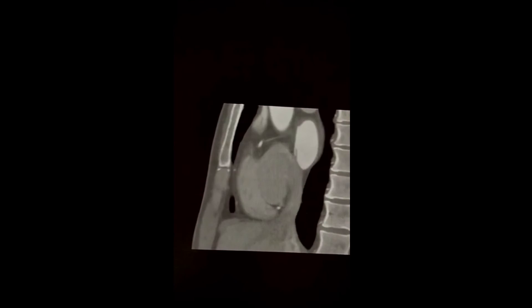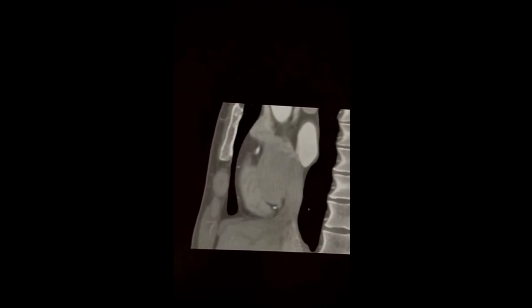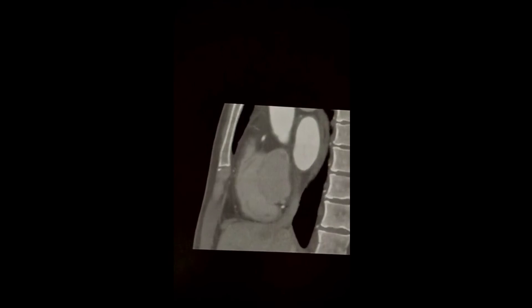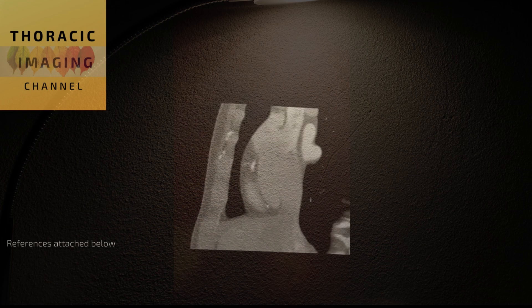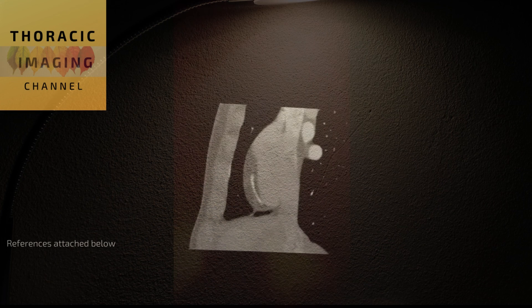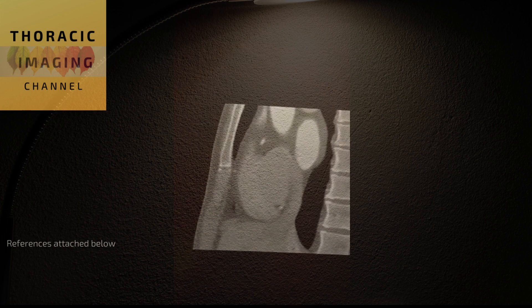And if you see a distinct jet it would classify as a true patent foramen ovale but in this case this may not necessarily imply a patent foramen ovale but gives a channel-like appearance.